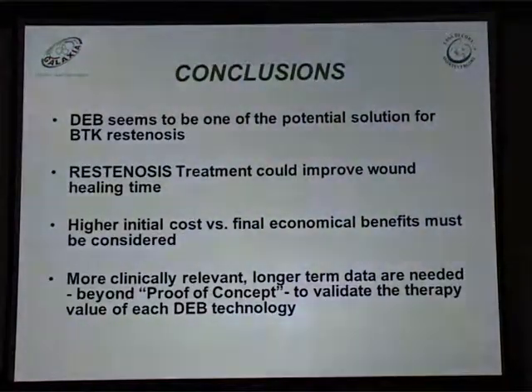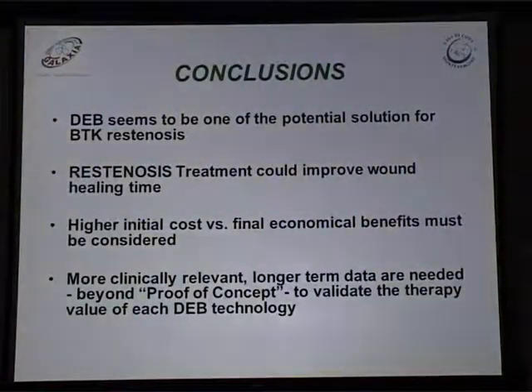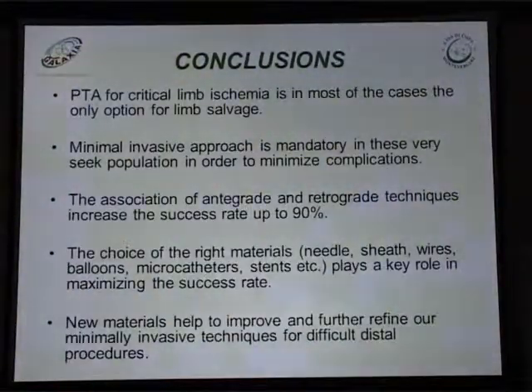So, in conclusion, I can say that drug-eluting balloons seem to be one of the potential solutions for below-the-knee restenosis. Restenosis treatment could improve wound healing time. High initial cost versus final economical benefits must be considered. But of course, more clinically relevant, longer-term data are needed beyond proof of concept to validate the value of each drug-eluting balloon technology.